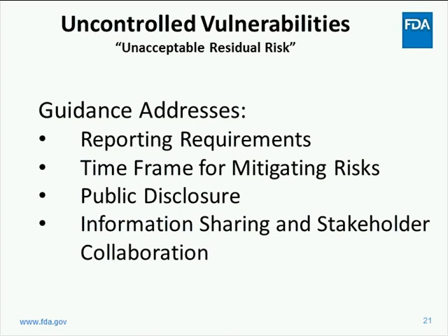If manufacturers can meet the 3 criteria, again, including no adverse events, remediation of the vulnerability within the provided time frame, and we'll speak to those time frames specifically in subsequent slides, and meet the criteria for active participation in an ISAO, then the reporting requirements of 806 would not be enforced. Manufacturers would be required to document the changes in their quality system, and it bears repeating that failure to correct a device when vulnerabilities are present that represent uncontrolled risk of patient harm could mean that the device is in violation of the Act.